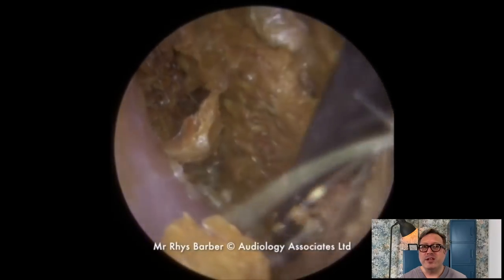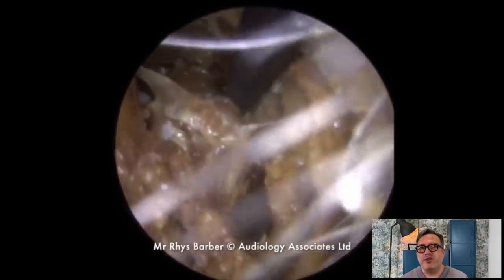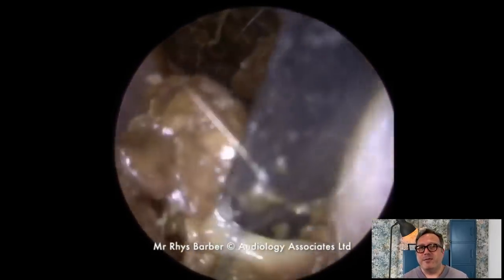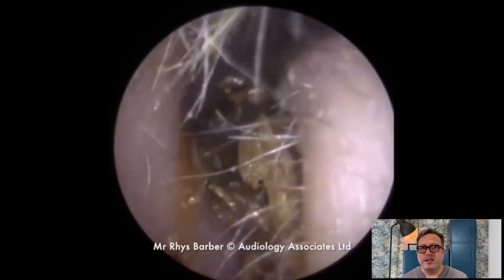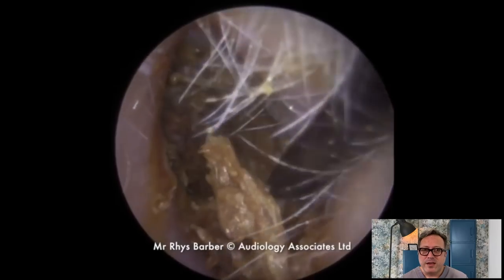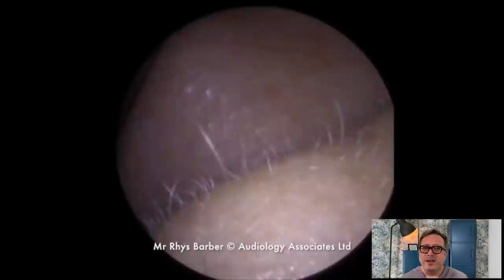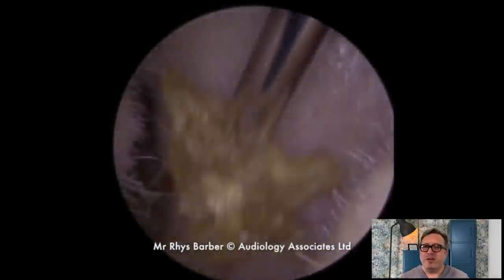Back in with the jobson horn now, loosening. Do you see that section of skin pull down there from the top? Just coming away really nicely, all starting to tease apart and break away. And the next section — wow. You do get these really big skin pieces coming away with keratosis.